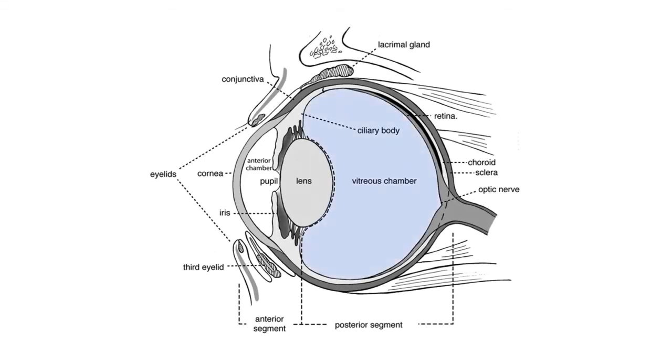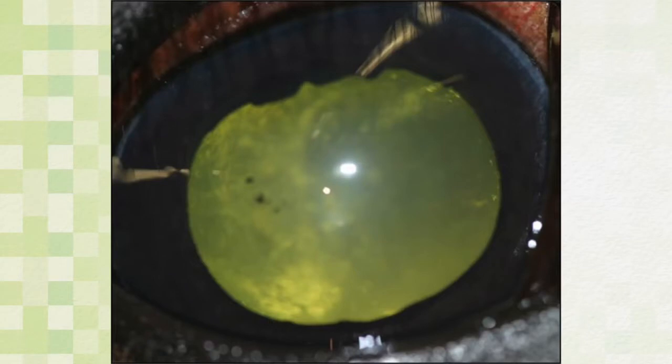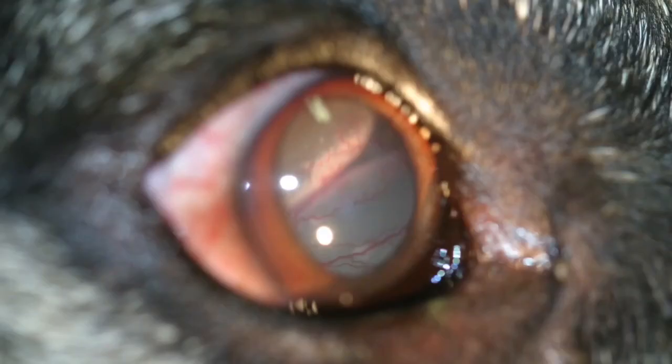Vitreous examination. The space between the lens and the retina contains the vitreous. The vitreous is normally a gel-like consistency and clear. Occasionally, vitreal opacities, such as persistent hyaloid remnants, vitreous degeneration, inflammation, hemorrhage, asteroid hyalosis, and retinal detachment, may be noted via retroillumination.